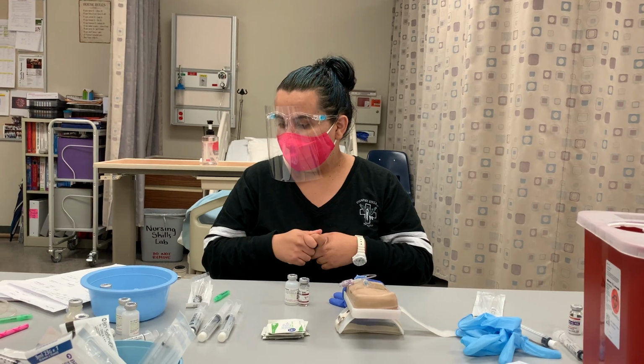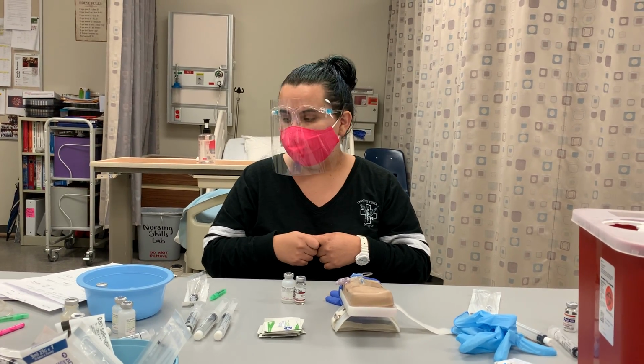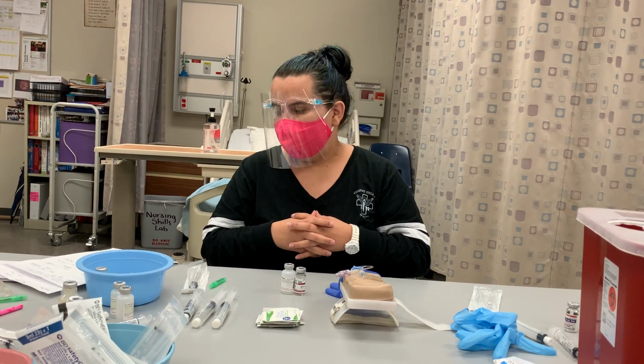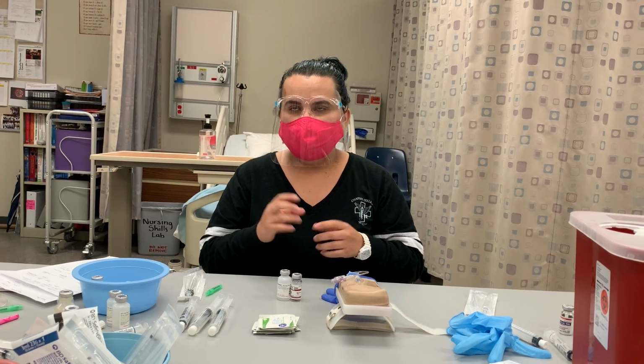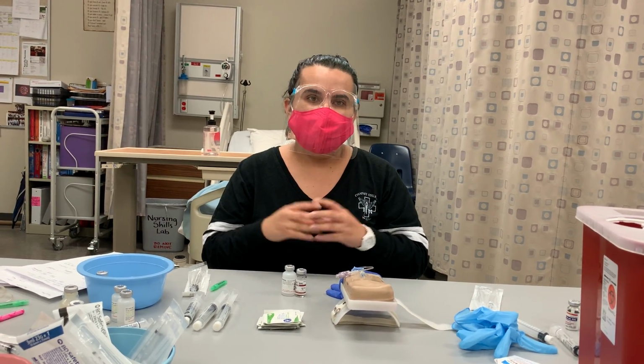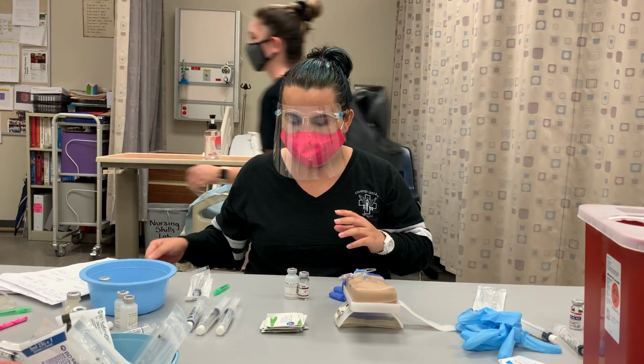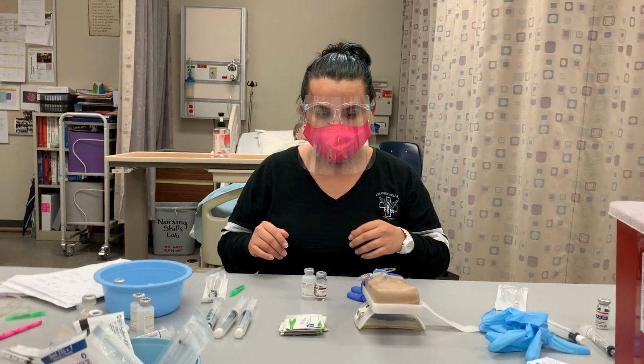Okay, so now I need to figure out how much I am going to give in 4 minutes. I'm going to be giving 1.5 ml every minute, which brings it down to 30 seconds. Every 30 seconds I'm going to be giving 0.75 ml, and it's going to be all over in a period of 4 minutes. So with this being said, let's get started.